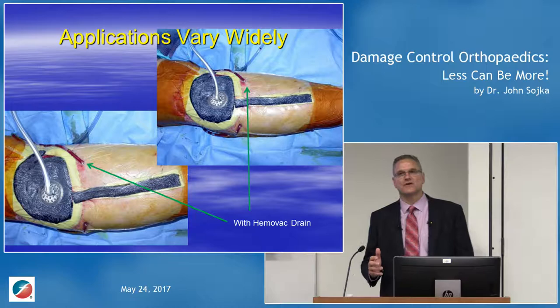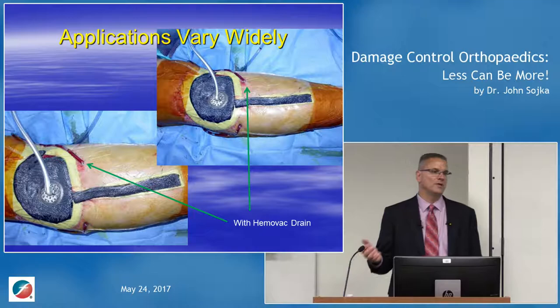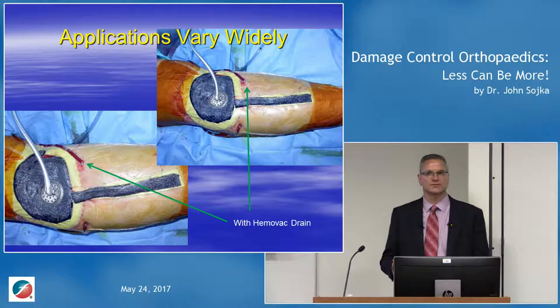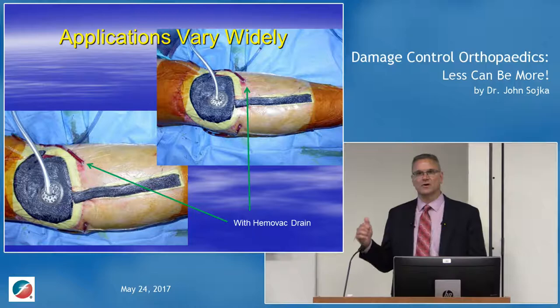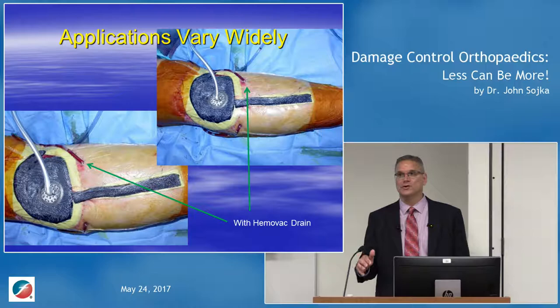The applications vary widely, and this is important to recognize too. In this particular instance, I was placing a wound vac on there in addition to placing drains, because of the continued oozing of the soft tissues, because this is a degloving injury all the way down. That whole venous plexus throughout that limb was really disrupted, and they will continue to ooze, especially if they're on some of the new modern day drugs, the Plavix, or even some of the older ones, the warfarins or Coumadins. And I think that this really works well to help drain the wound while at the same time providing a nice seal so that you're not continuing the colonization process, if you will.